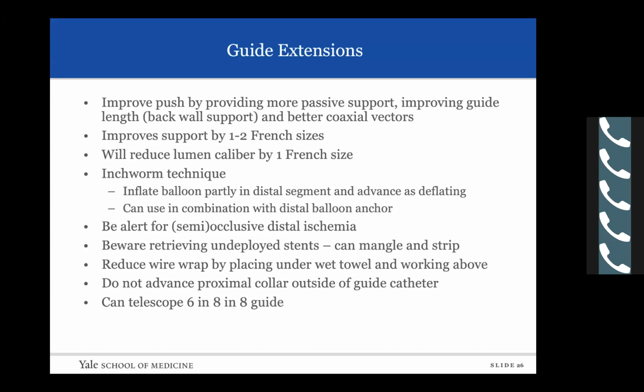And then you can do the triple telescope or the grandmother, mother, daughter technique, where you have an 8 guide and then an 8 guide extension, and then you can put a 6 guide extension through that. So that adds a great amount of stiffness. It also increases the length.